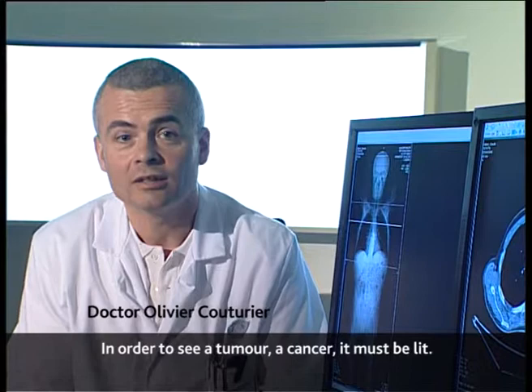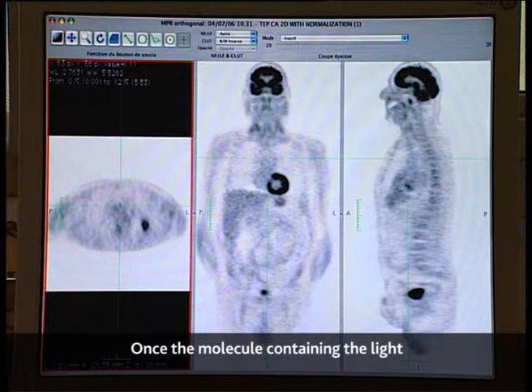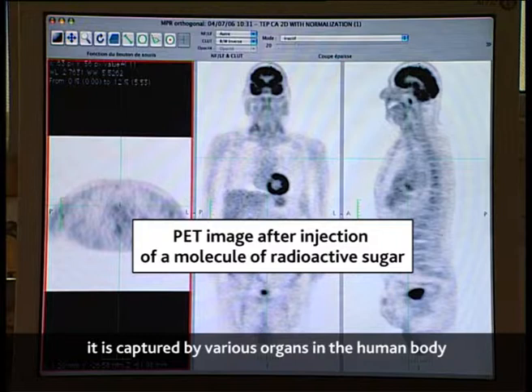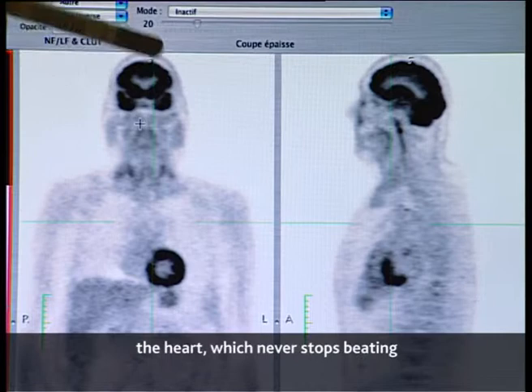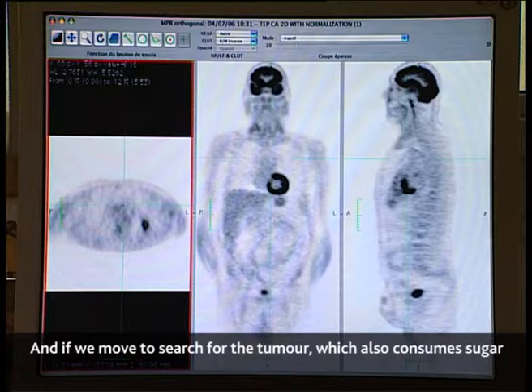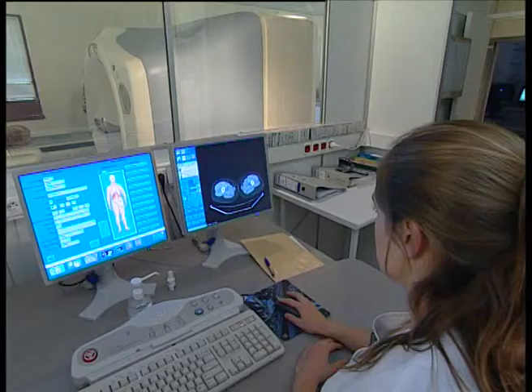To see a tumor or cancer, we need to illuminate it. In radiology, we can do this with x-rays. In nuclear medicine with PET, we bring the light to the tumor. Once the molecule containing the tracer has been injected into the patient, it is captured by various organs in the body — organs that normally consume sugar, like the brain and the heart. And if we are searching for a tumor, which also consumes sugar, we see it appear here at the thorax.